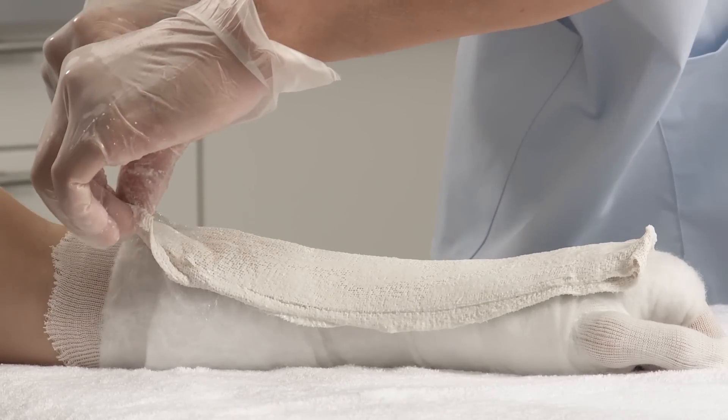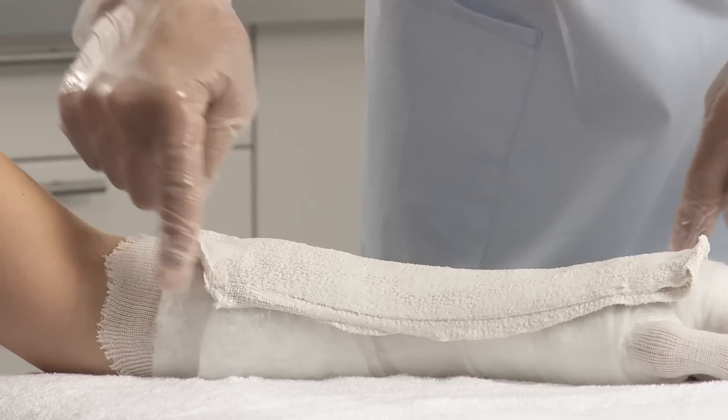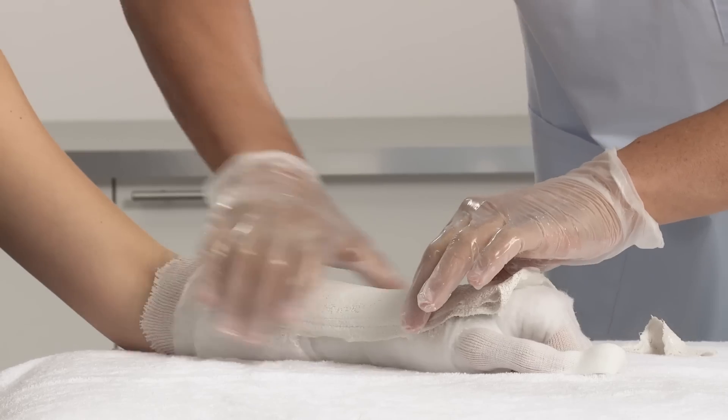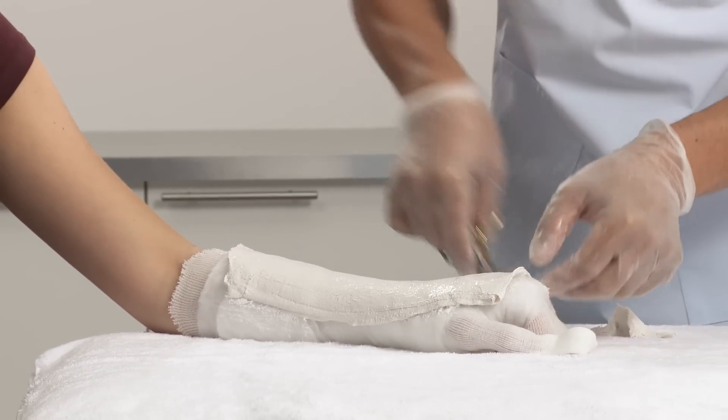At the corners, cut the splint to size, first at the proximal end, ensuring it still allows for the stockinette to be folded back. Then cut the corners at the distal end.